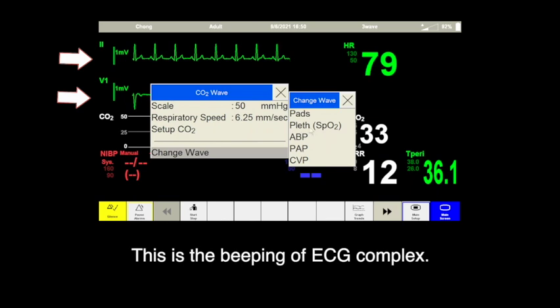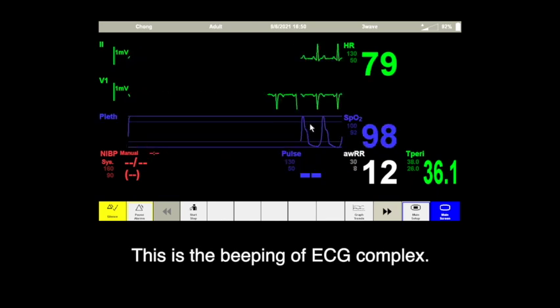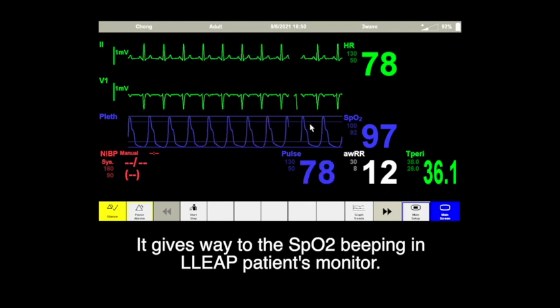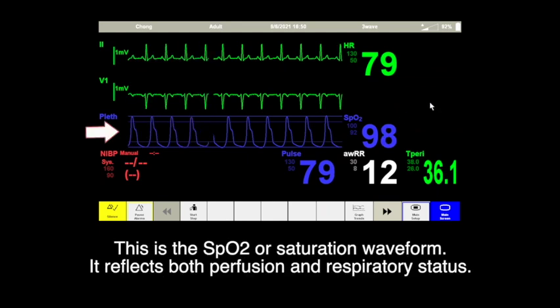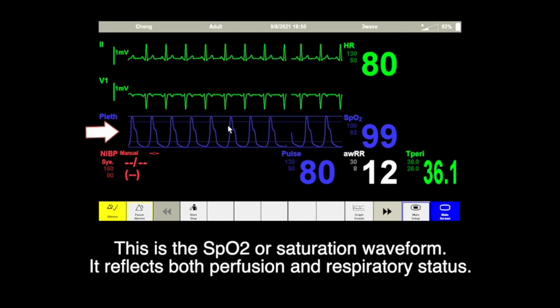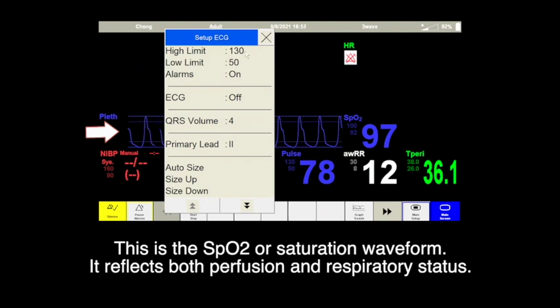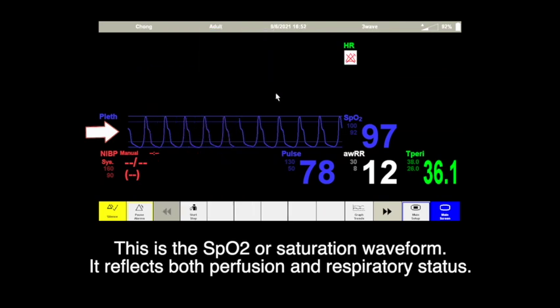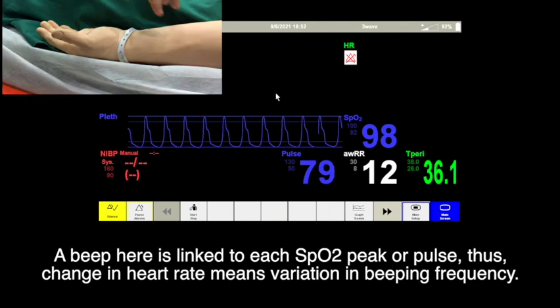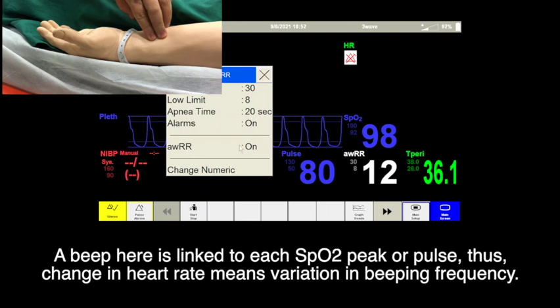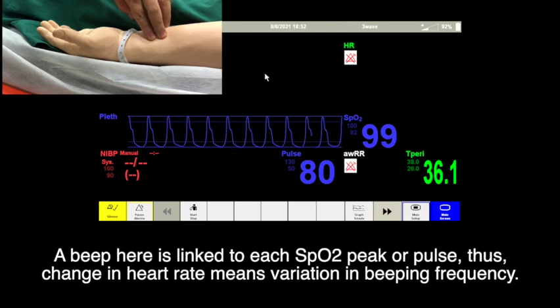This is the beeping of the ECG complex. It gives way to SpO2 beeping in the LiP patient's monitor. This is the SpO2 or saturation waveform — it reflects both perfusion and respiratory status with numeric percentage, graphic waveforms, and audio beeping. A beep here is linked to each SpO2 peak or pulse. Thus, a change in heart rate means variations in beeping frequency.